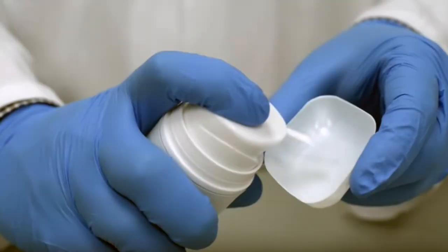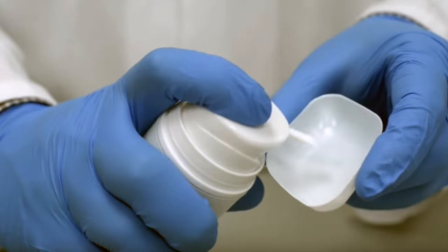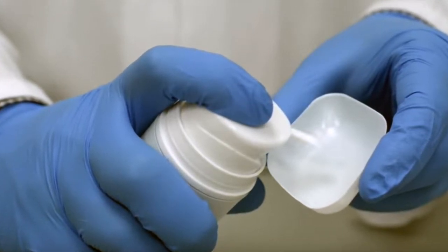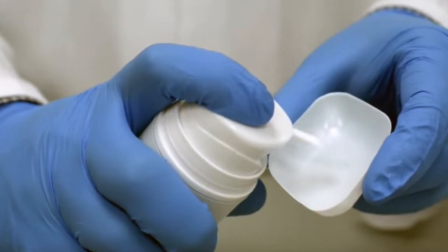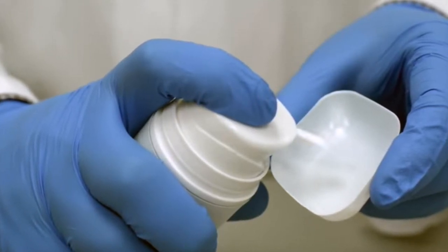To dispense half an ml or 0.5 ml of cream, push the pump down firmly one time. To dispense one ml of cream, push the pump firmly down two times.